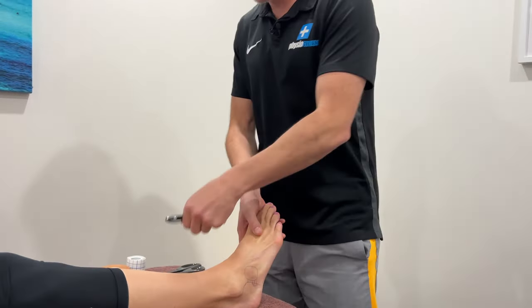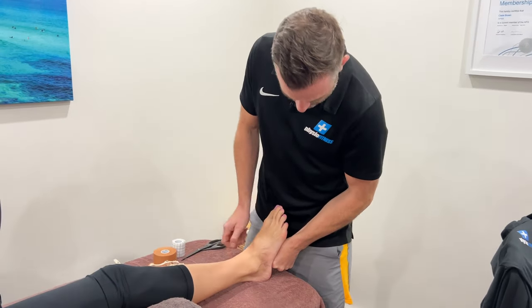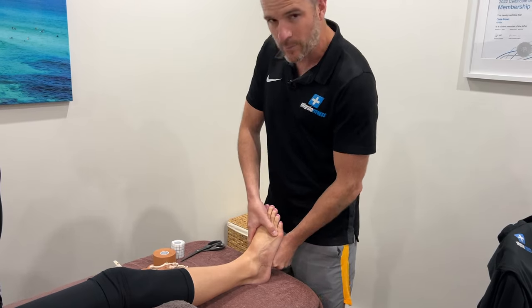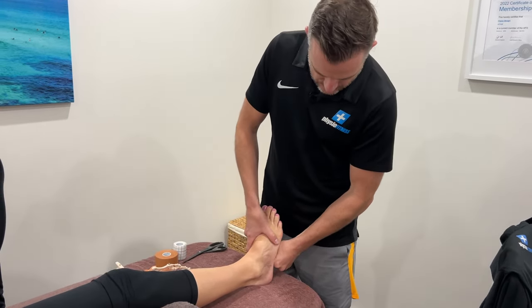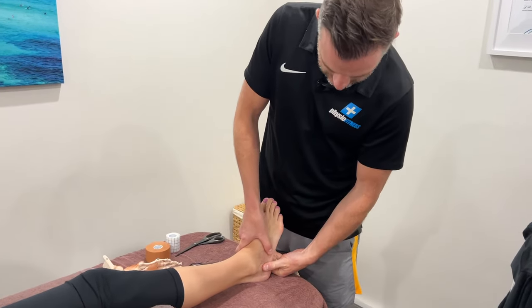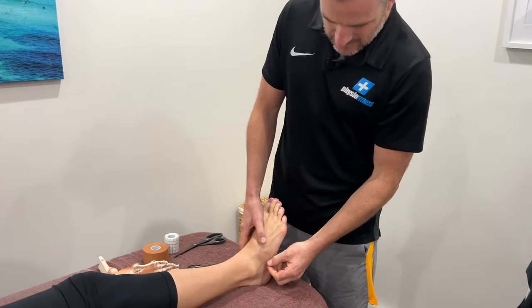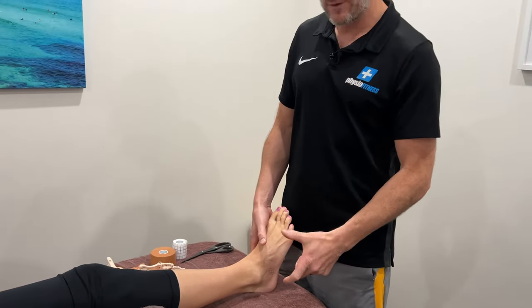What we're going to try and do is tape it to hold these two bones together. The easiest way of doing that is bringing the tape up so I'm taping her cuboid to keep it up. So when she does a movement of inversion and lands and plants her foot, she's not getting any movement there - not separating - so it ends up healing properly. Otherwise it's always going to keep being sore and she's going to start getting some serious weakness if we don't stabilize it.